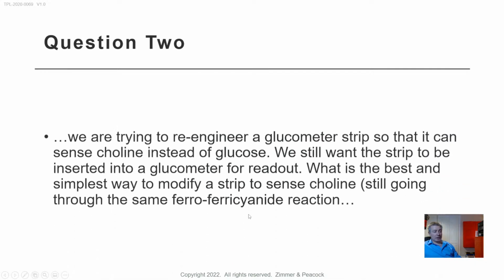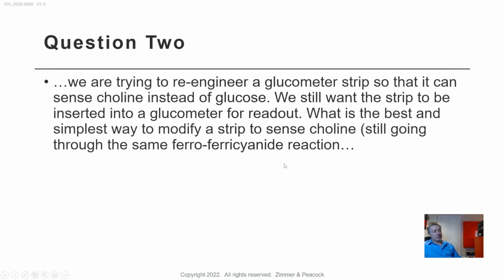Now, question number two is this group is trying to repurpose a glucose strip to be a choline sensor, and they use a glucometer for a readout.